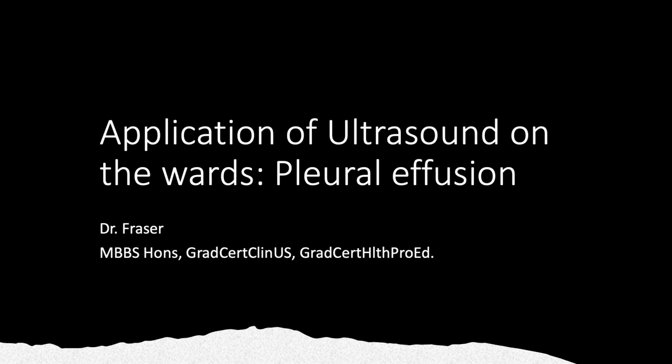I'm a doctor in Australia and I'm going to present a case that I saw where I used some ultrasound to diagnose pleural effusion and essentially help me clinch a diagnosis on the wards in the middle of the night.